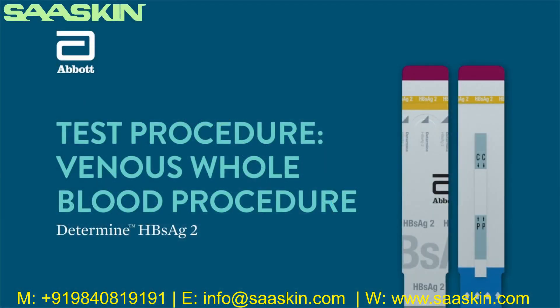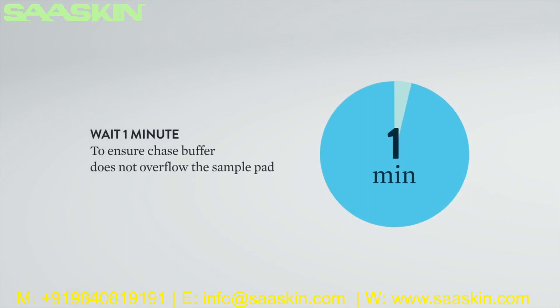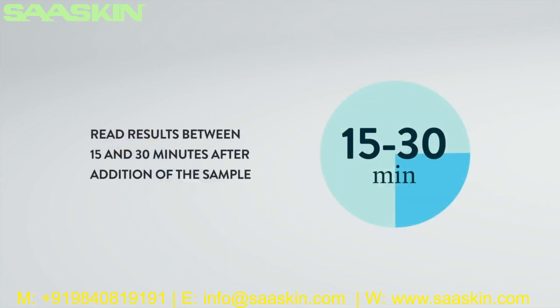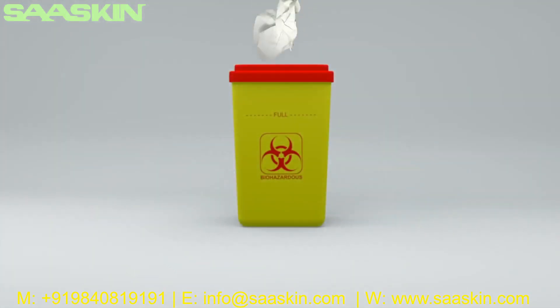Venous whole blood procedure: Using the precision pipette with a disposable tip, apply 50 microliters of whole blood by touching the tip of the pipette to the middle of the sample pad, marked by the arrow symbol. When all of the blood is transferred to the sample pad, wait one minute to ensure the chase buffer does not overflow the sample pad. Then add one drop of chase buffer to the sample pad. Only liquid provided in the chase buffer bottle should be used — do not use water or other liquids. Read the test result between 15 and 30 minutes after the addition of the whole blood. Do not read the test results after 30 minutes. Discard the used pipette disposable tip, test units, and any other test material into a biohazard waste container.